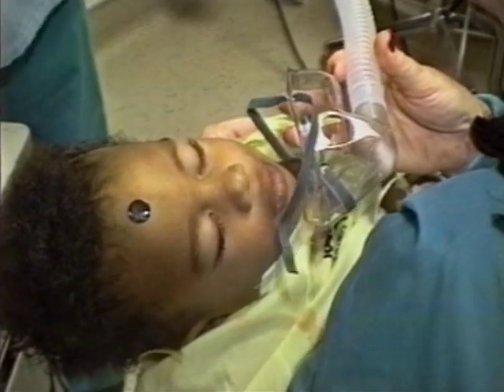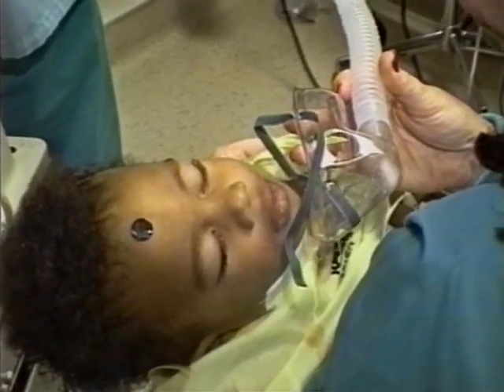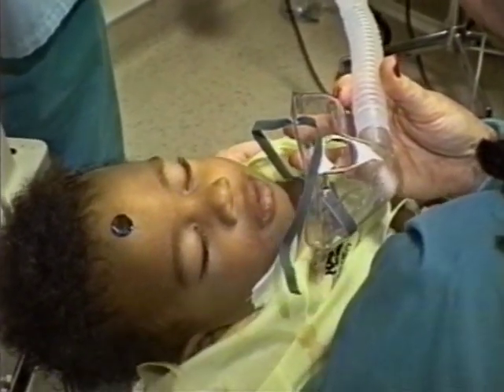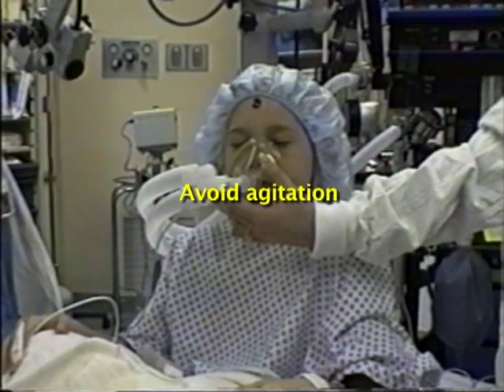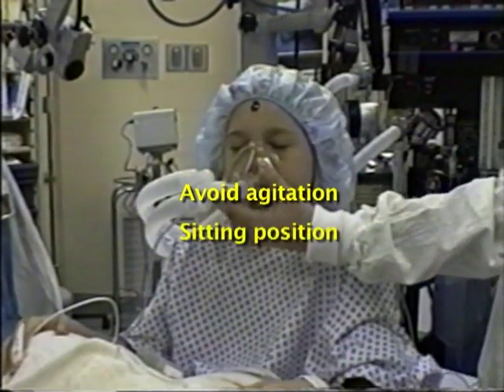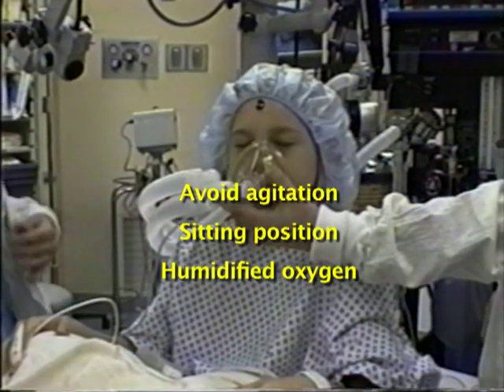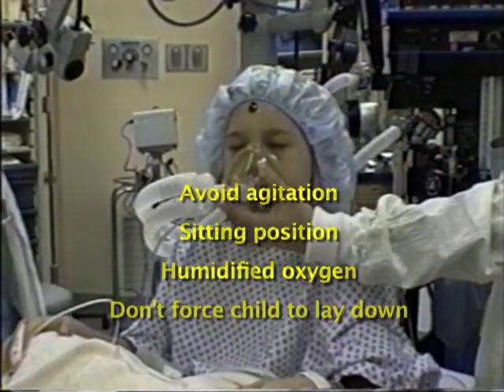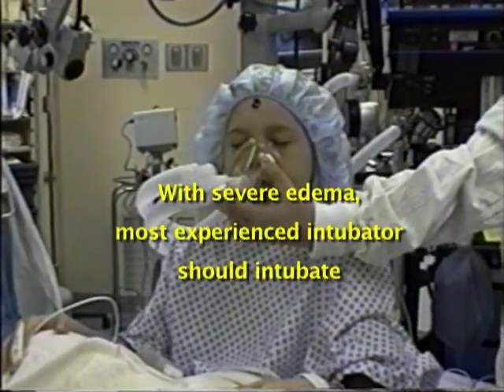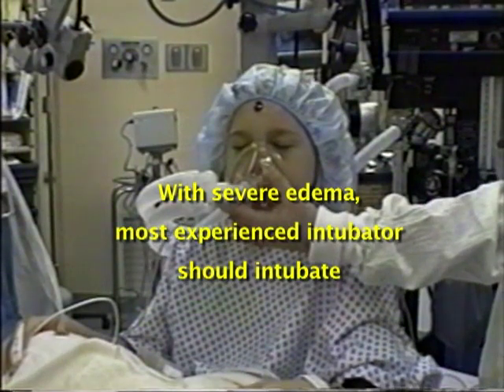These children are in danger of complete airway obstruction. Someone knowledgeable about airway management must accompany them at all times until the danger from obstruction is past. Avoid agitating the patient. Let them remain sitting and keep them calm. Provide humidified, high-concentration oxygen. Don't force the child to lay down. If severe edema is present, the most experienced intubator should intubate when possible.